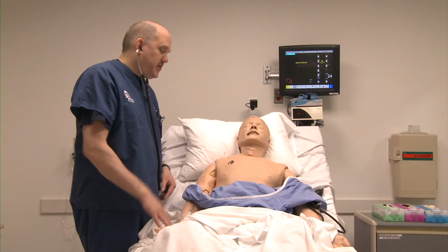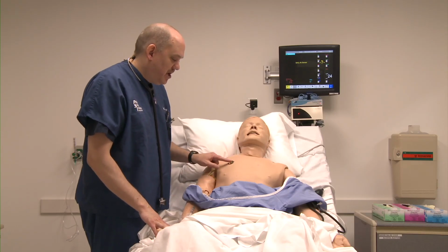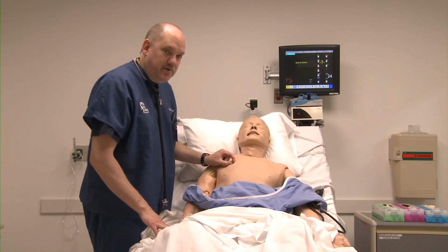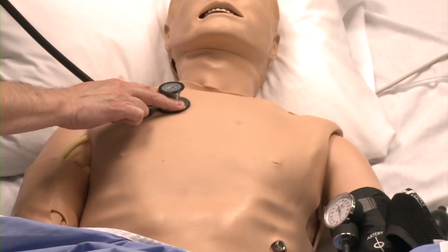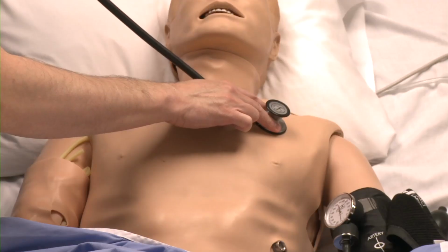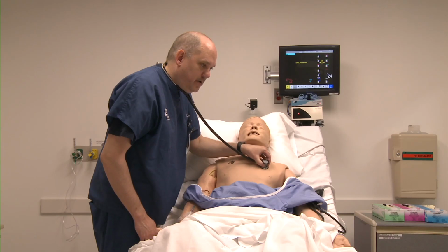The patient's breath sounds are heard best by listening to the breath sound speakers. And those speakers are just above and medial to this big nub here that we use for our hands-free defib paddles. So we want to put our stethoscope there and at about the same location on the left side of the chest. And once again, if you move your stethoscope an eighth or a quarter of an inch in either direction, that may improve what you hear.